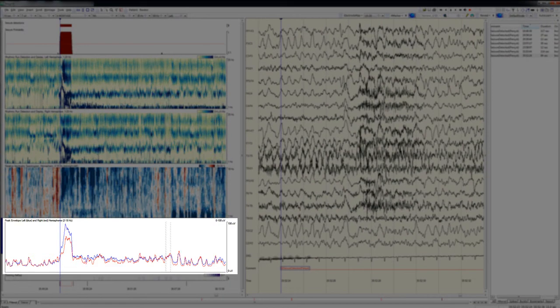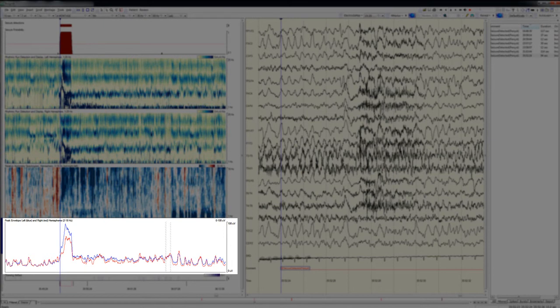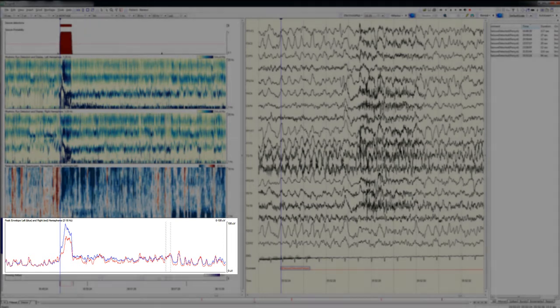Next is a graph showing two lines that represent the average amplitude of the EEG envelope in the left and right hemispheres. This provides a general indication of the amplitude of the EEG on the left and right, with the left being shown as a blue line and the right as a red line.